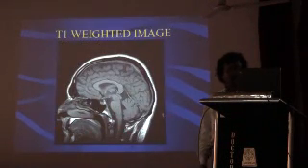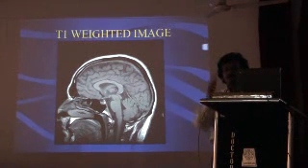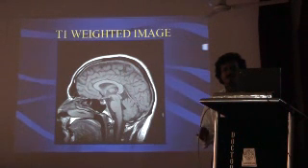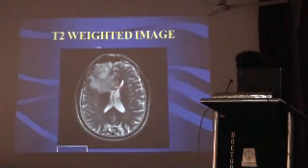I'll show you. Now a T1 weighted image is like this, a sagittal image, where the fluid is dark, as if you are looking at a CT scan. What you get in a CT film, the same appearance is in the T1 weighted image. T2 is very simple. In T2 the CSF is white or hyperintense. So this is a T2 weighted image, where CSF is white.